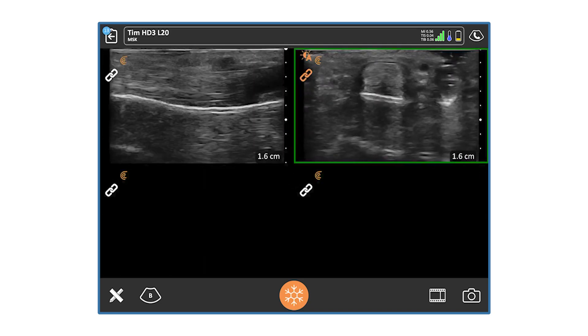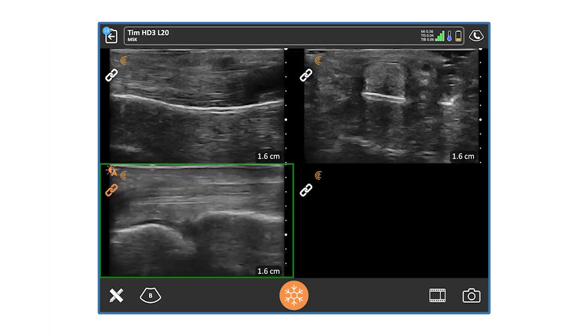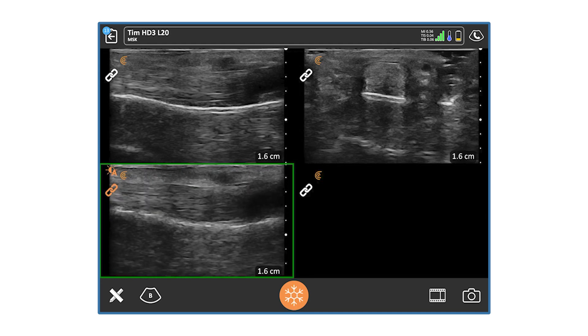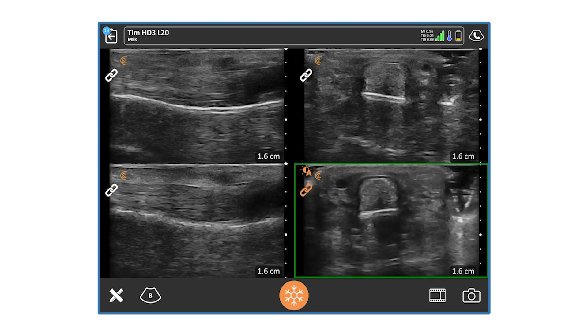Once I capture the transverse image, I'll go to the opposite hand, apply a copious amount of ultrasound gel on the opposite finger, and place the transducer over that region. I'm looking, analyzing, comparing, and contrasting — trying to get that same view on the opposite side. Once I have that ideal view, I'll screenshot it, then go into the transverse view to get the compare and contrast to the opposite side, and take that screenshot.